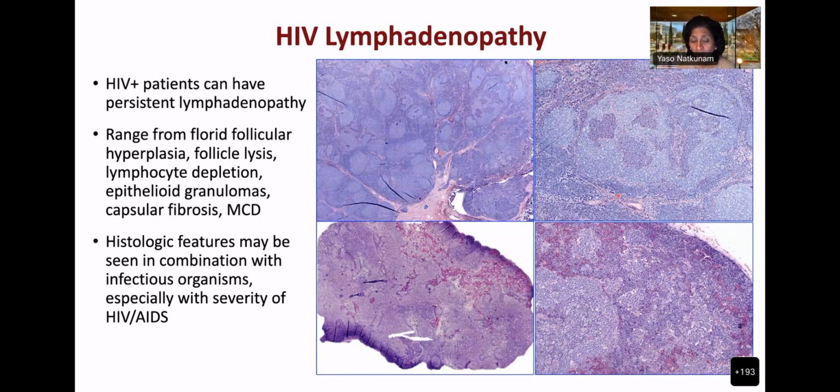It's true about the lymph node, also the GI tract and other common places that are biopsied where you may have small pieces of tissue, and even a follicular architecture is difficult to appreciate. So CD21 can be extremely helpful in these cases.